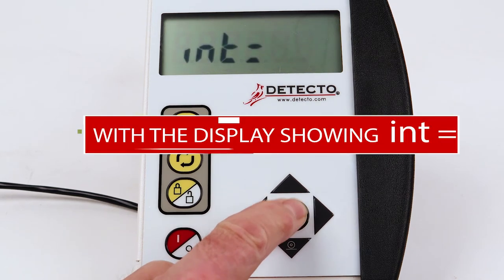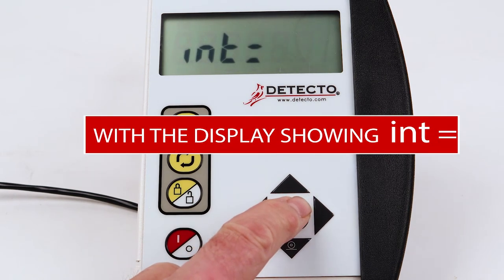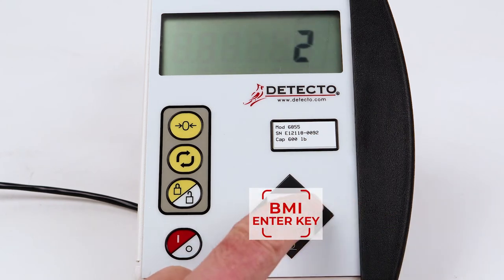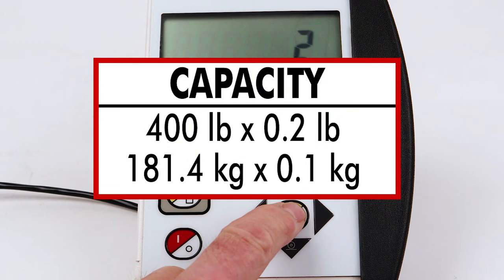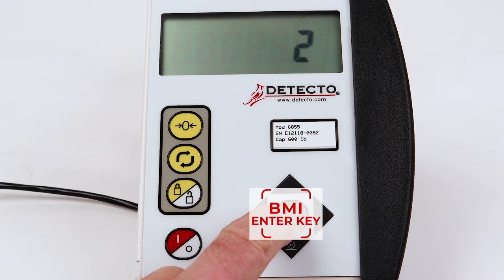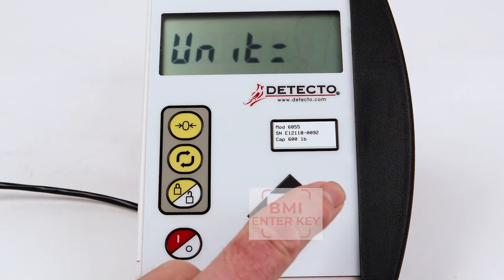With the display showing INT equal for the interval setting, press the BMI Enter key to show the current setting. If the setting is the same as the interval from the label or serial number — it will be 1, 2, or 5 — press the BMI Enter key. Otherwise, press the up or down arrow keys to select the correct interval and press the BMI Enter key.